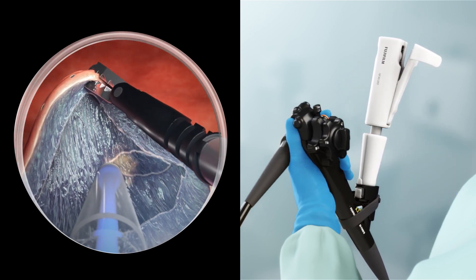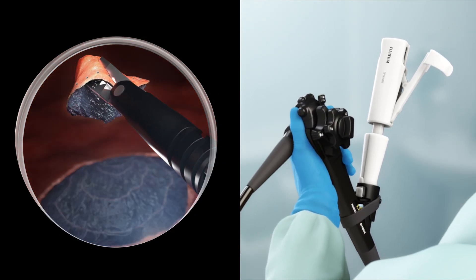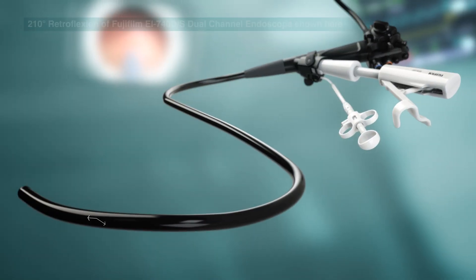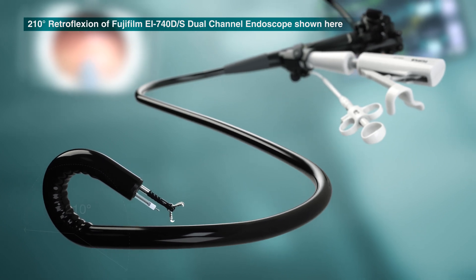The sequence is repeated until the lesion is fully detached from the mucosa and safely removed. ESD procedures can also be performed in retroflexion using Track Motion with a dual-channel endoscope.